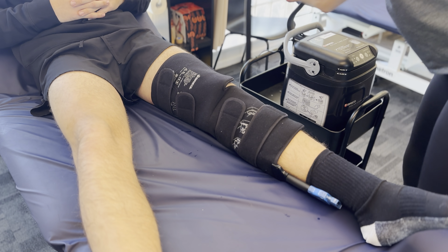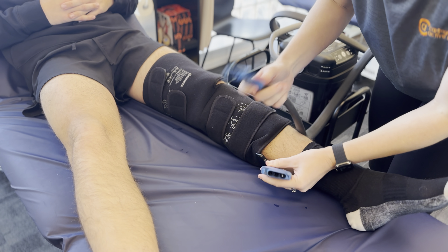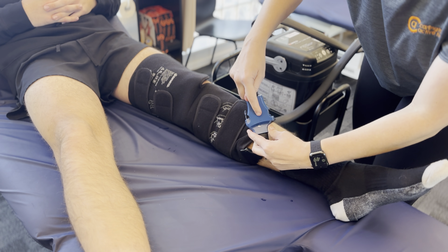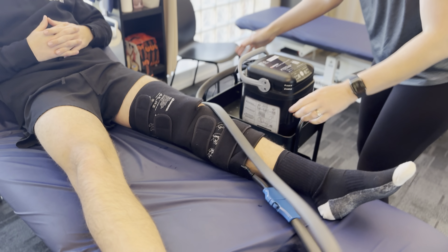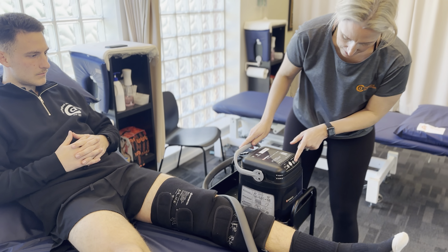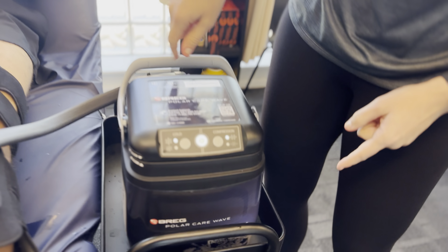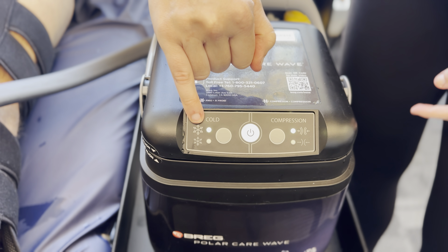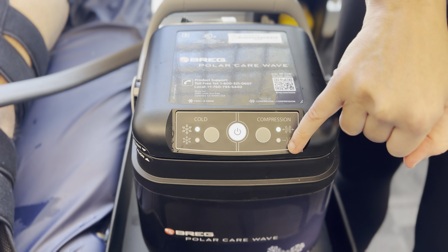Once you've done that, you will then get the attachment that matches. One way connects in — easy way to remember: the two logos click into each other and you're in. Once you've got that there, press the power button on. There's not much on here other than the big snowflake, which is super cold versus not so cold, with compression and extra compression versus lighter compression.